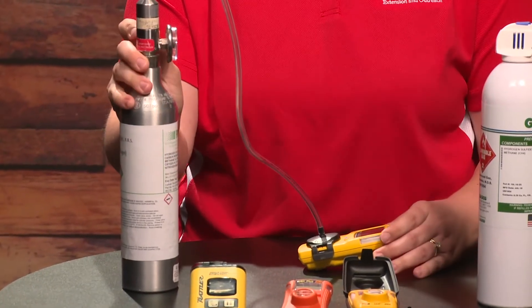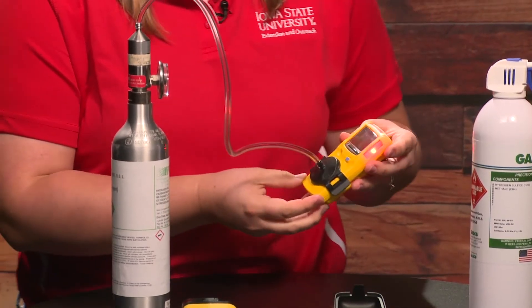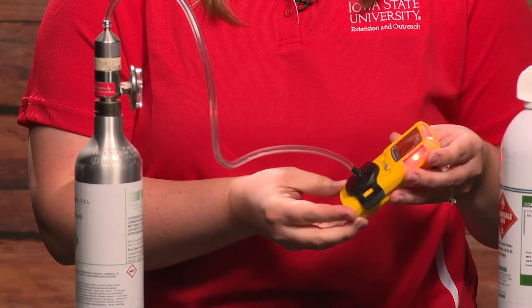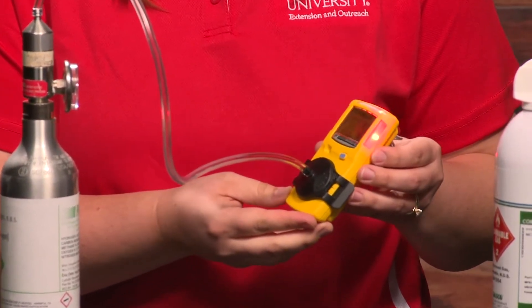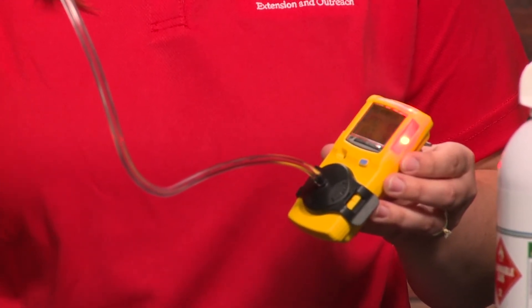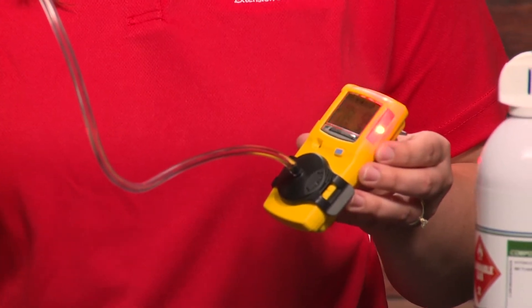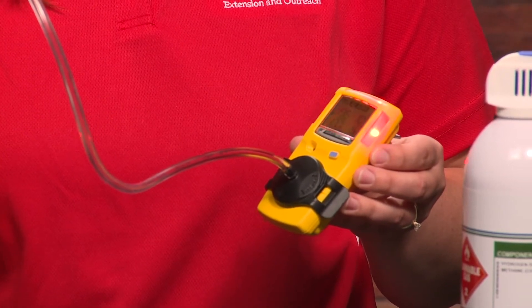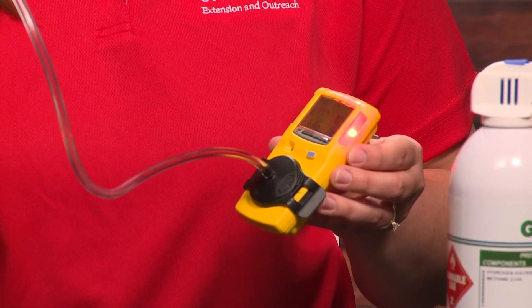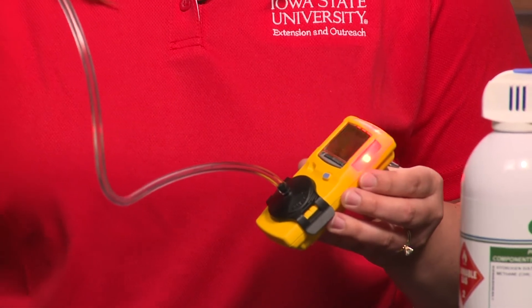I hear a hissing. We're monitoring at 10 and 15 parts per million. I'm going to turn this off now.